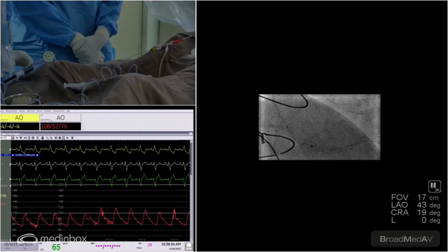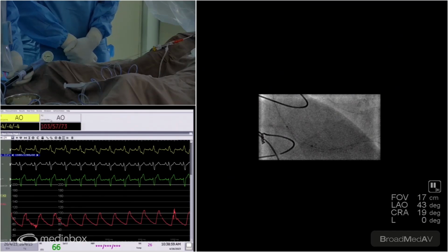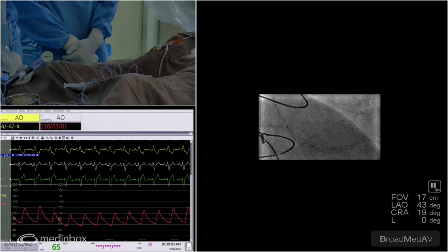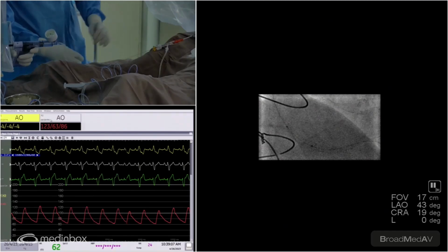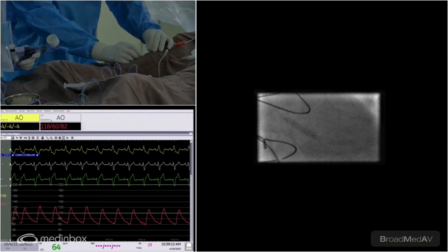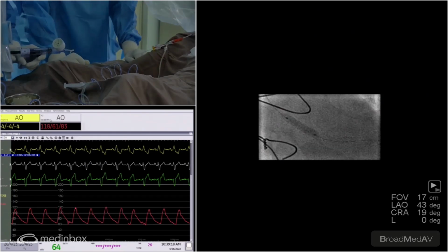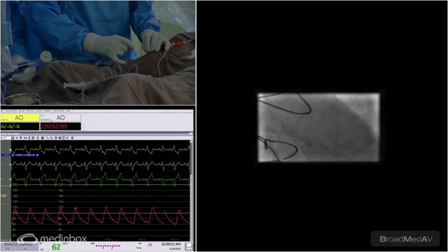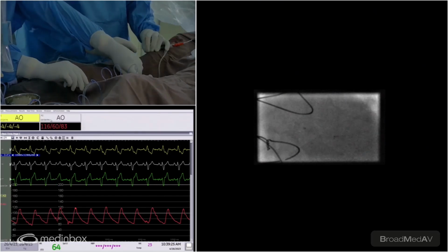We use both stent boost and IVUS to make decisions on how your stents have expanded. I think there's some utility of stent boost, especially with fractured stents. All right. We can also see very clearly now how nicely we can see. I'm just pushing it a bit in. Go up, please. 20. So it's well expanded. This is the proximal 3.5 at 20. Obviously the stent boost showed some under expansion, but looking at it, I think it's good. Go back, please.